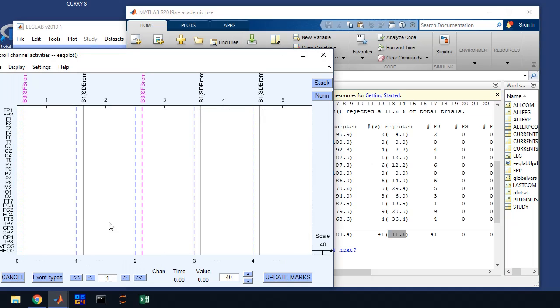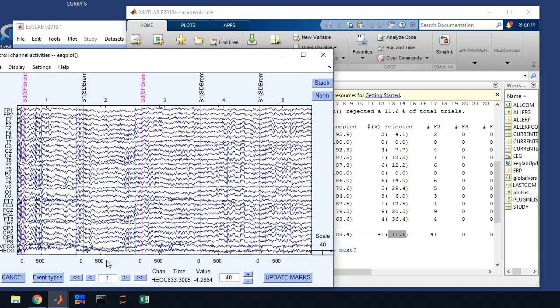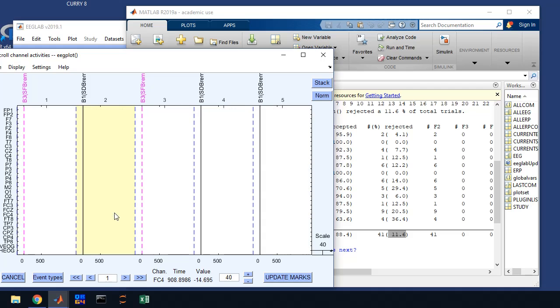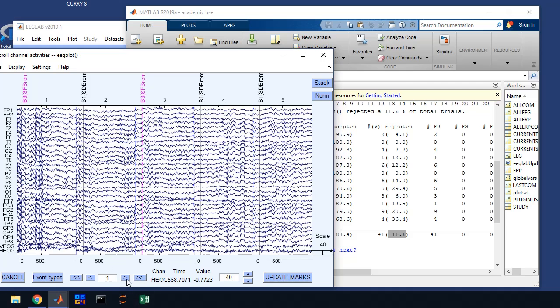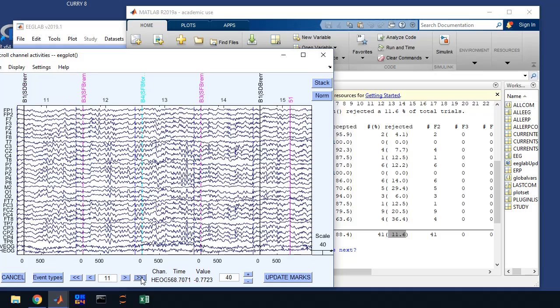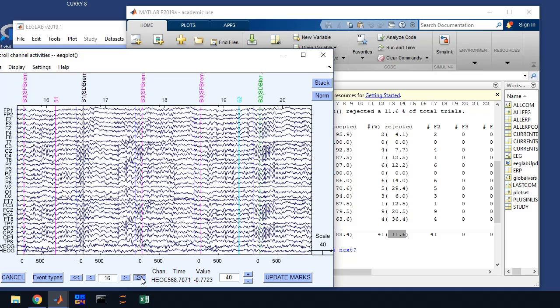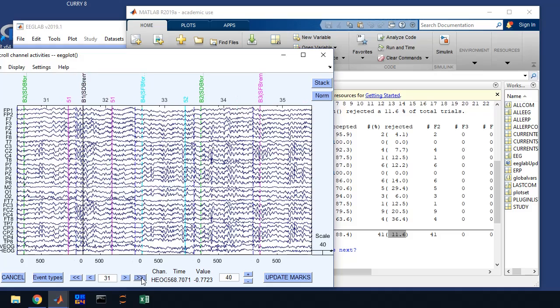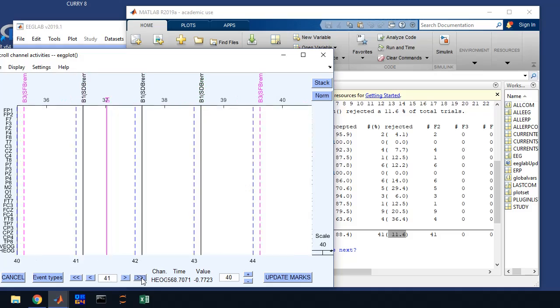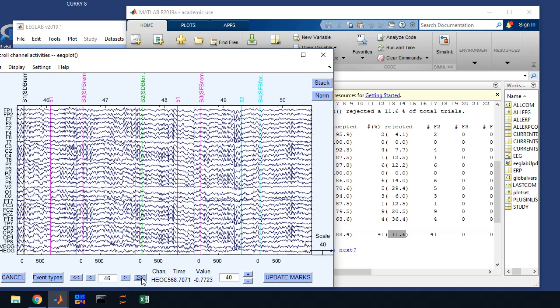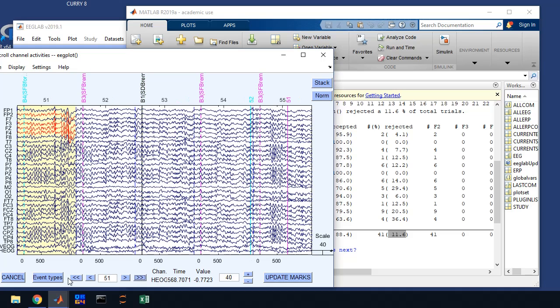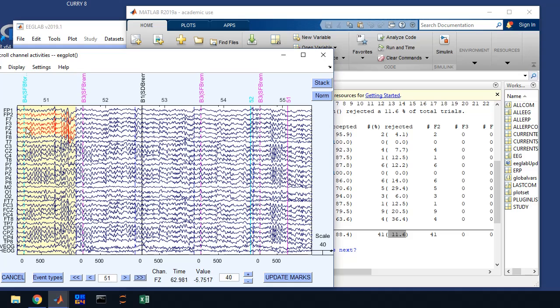So let me show you what it looks like. If you click on these, it'll remove and turn it yellow. That removes it for rejection manually. You don't want to do that. So we're going to scroll through the data. We'll try to find one of the trials that was rejected by this algorithm. It'll show up as being yellow, kind of like it did when I accidentally clicked on it. There we go. And you can see it puts in red the channels that were rejected based on this algorithm. Sometimes this leads you to do a better detection or examination of channels if it's really bad and hope to recover some of the data. But that's what it looks like.